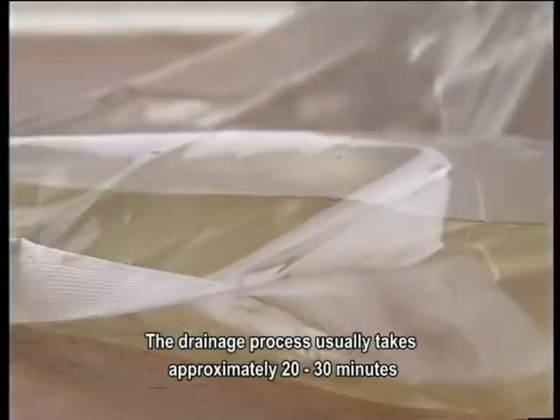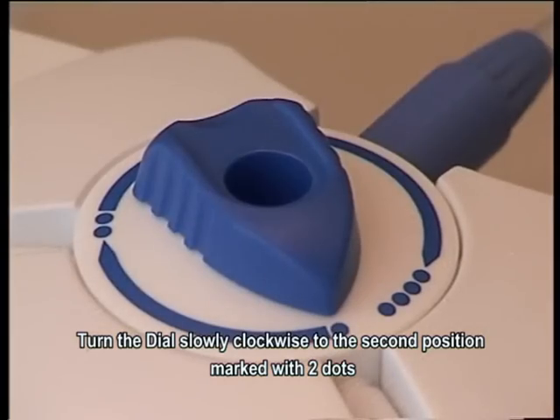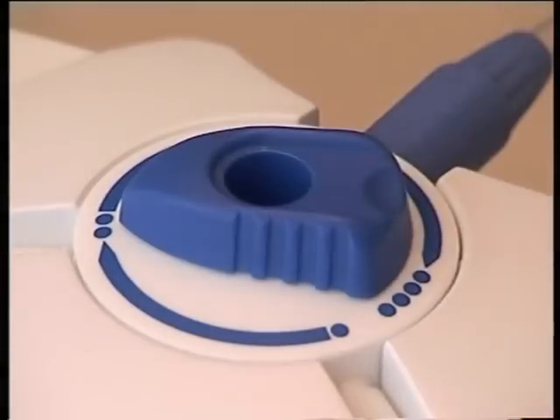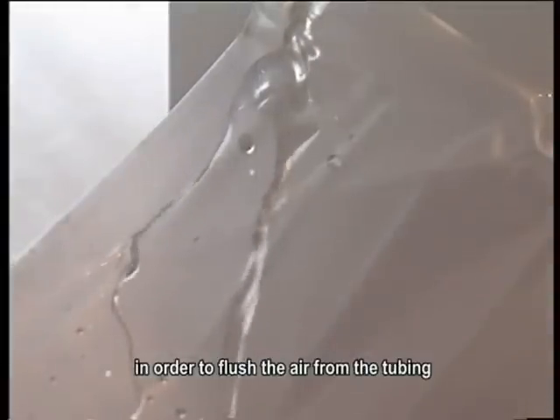The drainage process usually takes approximately 20 to 30 minutes. Your PD center will teach you how to know when you have completed the drainage. Turn the dial slowly clockwise to the second position marked with two dots. Then count to 5. The fluid will pass from the solution bag directly to the drainage bag in order to flush the air from the tubing.